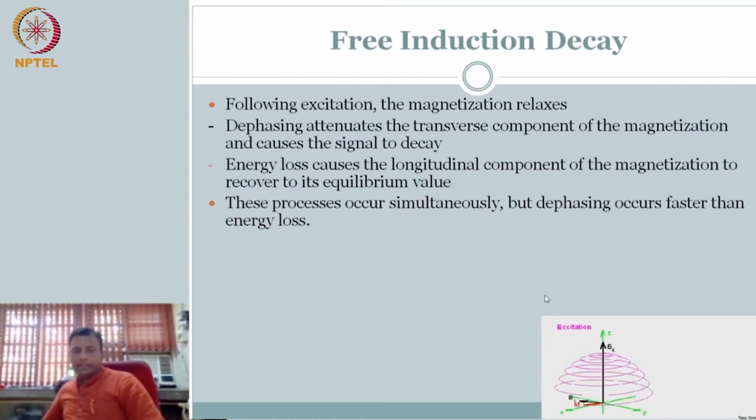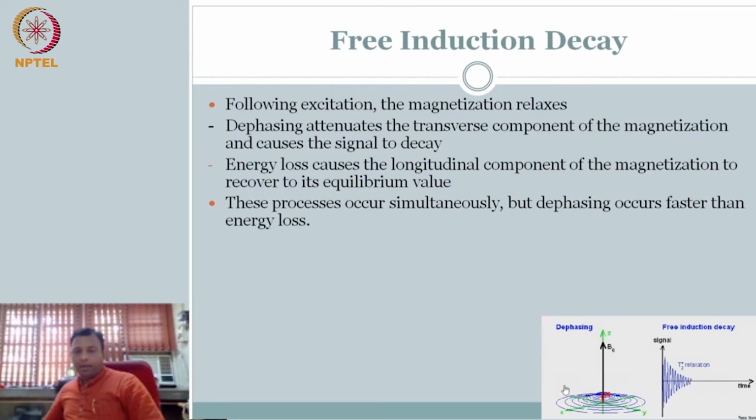First, when you are applying excitation, it is dephasing. Only when it is on the XY plane, this will play again. Okay, look at the different variations. You can play this several times to understand, but notice the process that we are interested in. Initially, when you excite, there is no signal. The M has to fall onto the floor. The moment it falls on the floor, you get the maximum peak signal, right? And then the M starts to reduce because of dephasing. So the signal goes down.